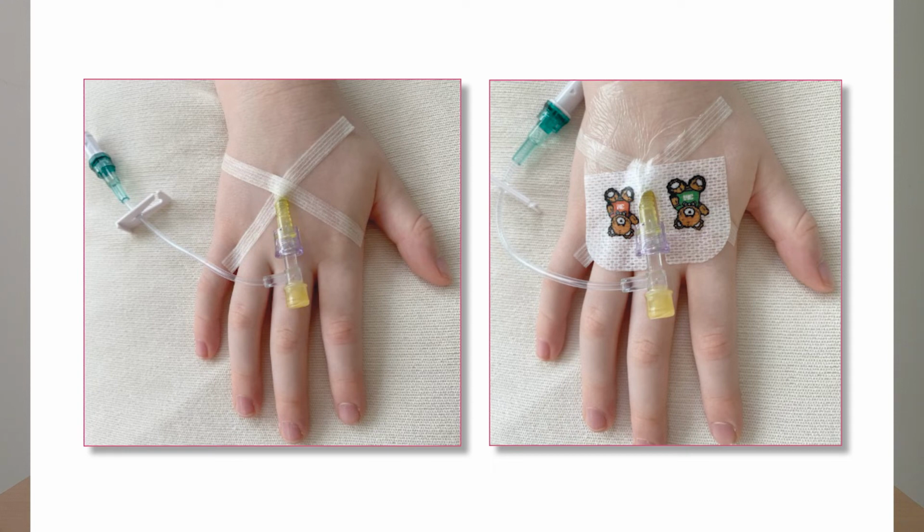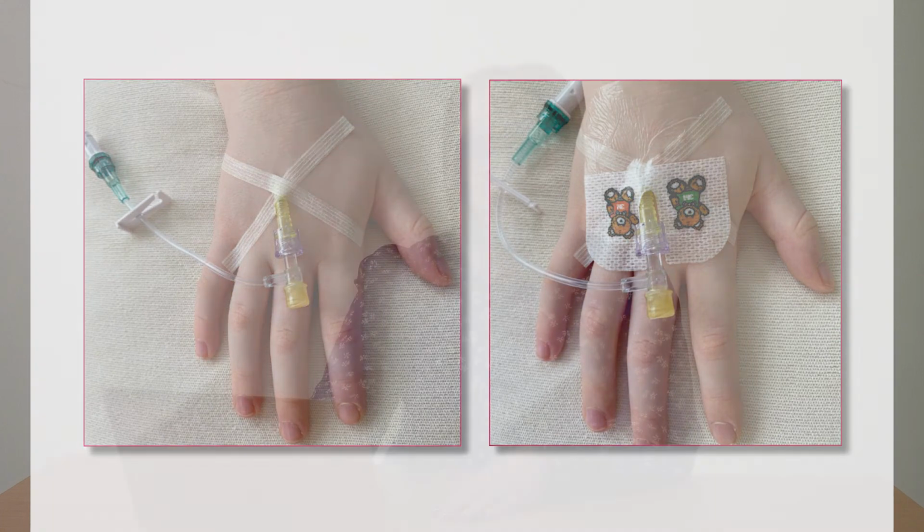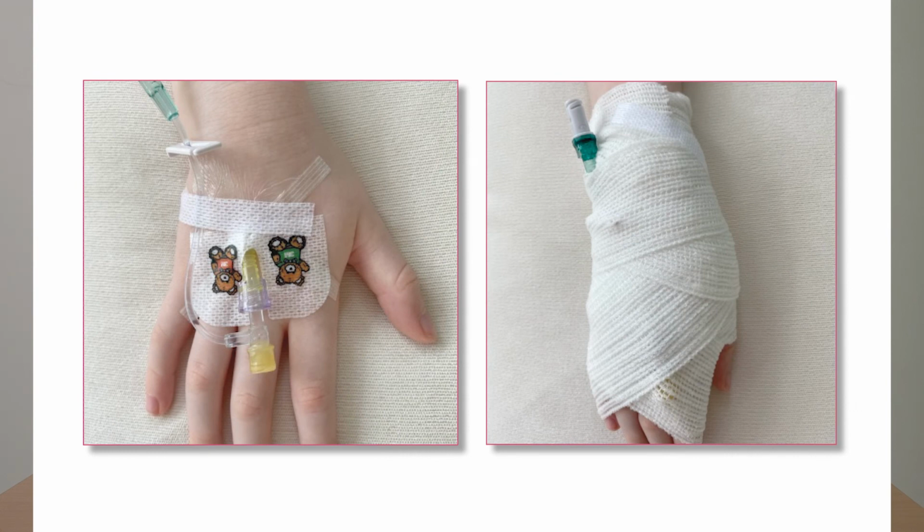Next, use your cannula dressing, something with a clear window, with teddy bears and added extra. And it's often helpful to add a little bit of tape to your extension tubing, and this will take a little bit of weight off it to stop it pulling and accidentally dislodging the cannula. And then finally, bandage it all up. This can be done with a normal crepe bandage, or some tube grip will also work. And sometimes with the little ones, using a sock or a mitt over the top of that can also help.